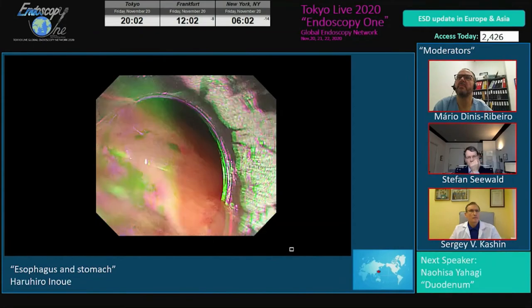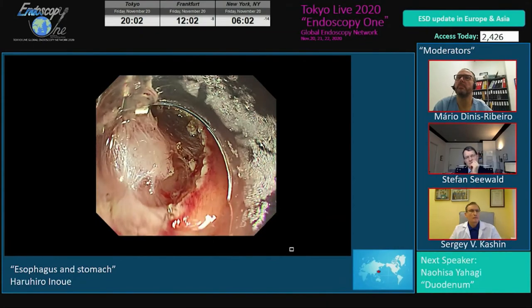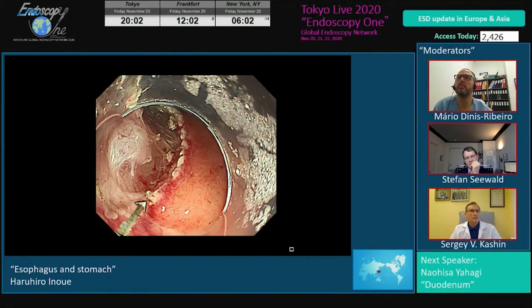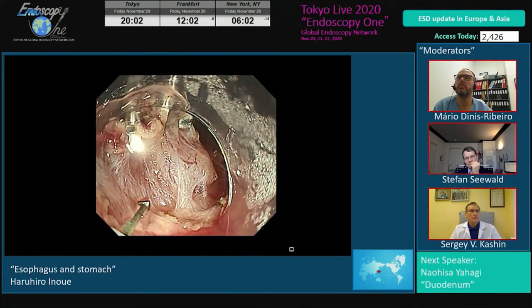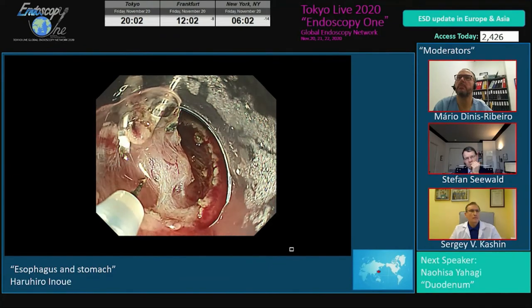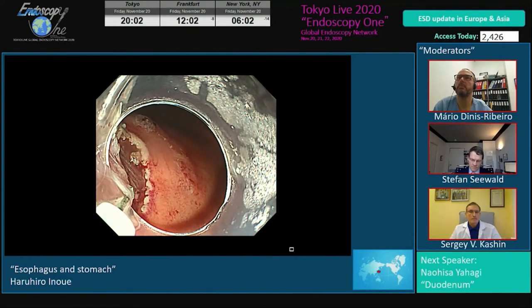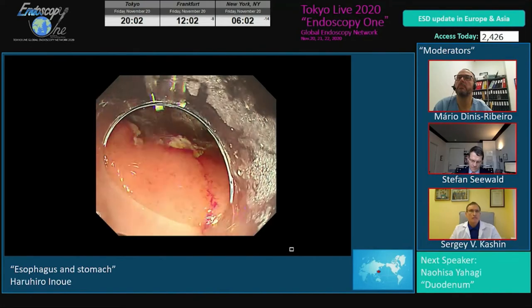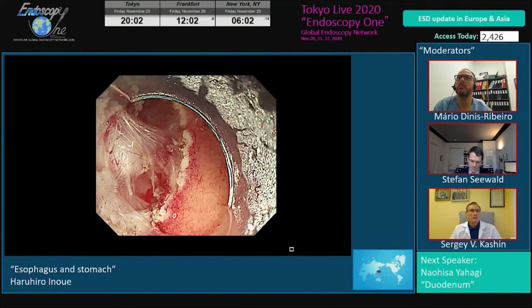In this case, it is very difficult to differentiate the muscle layer and the submucosa. Anyway, the muscle layer is going behind the submucosal tumor. Okay, scoop the tissue up and then cut. At this moment, we can always keep a good view because of the counter traction.